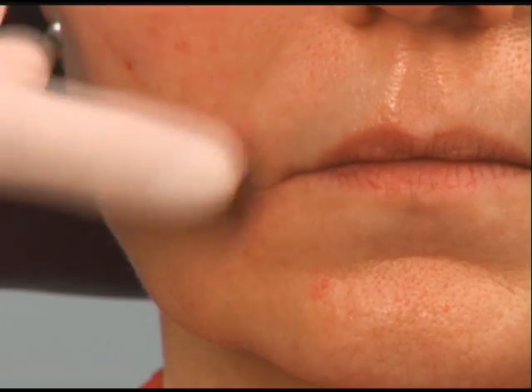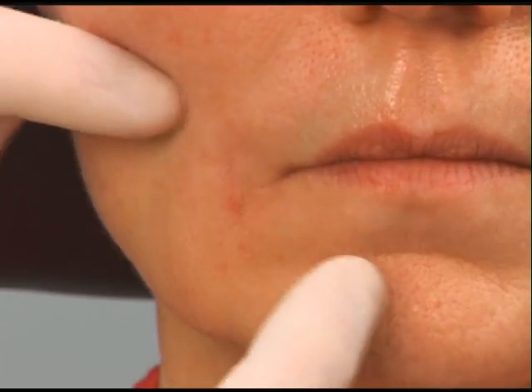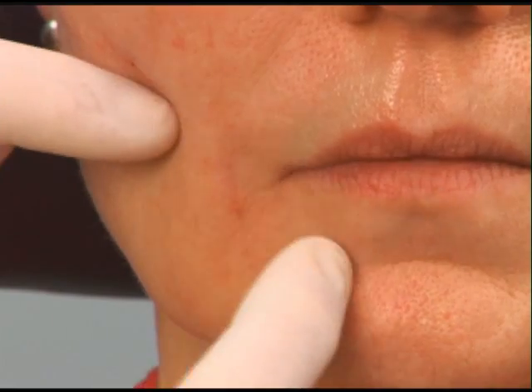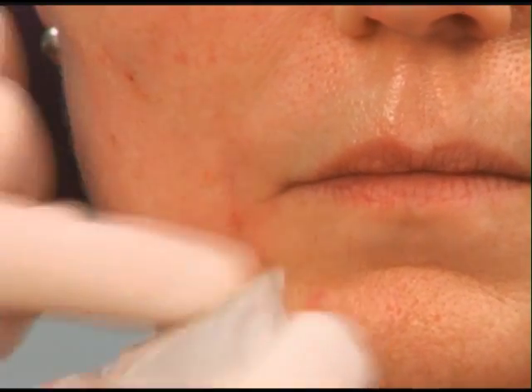I'm pretty happy right now with the nasolabial fold the way it is, so what I'll do next is come down and do the marionettes — or even just the oral commissures — where we want to get rid of that depression that makes it look like the corners go down farther.